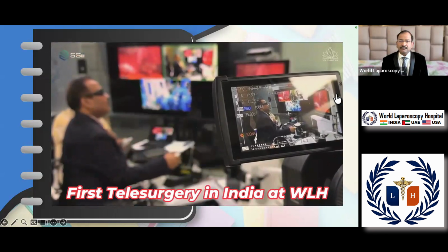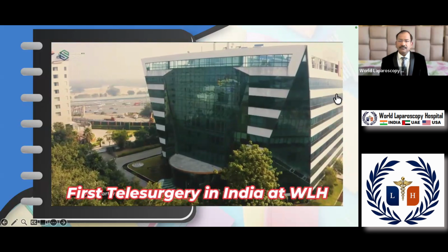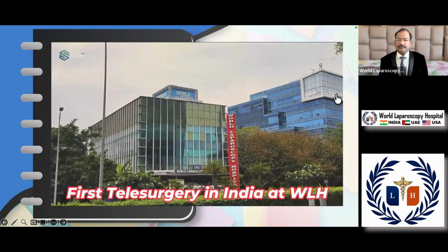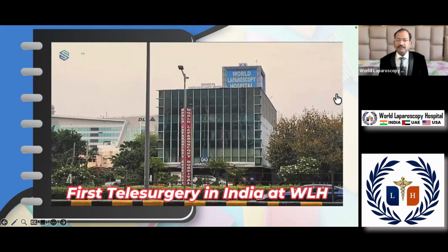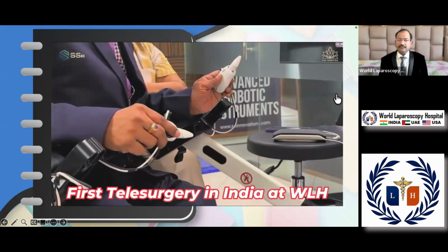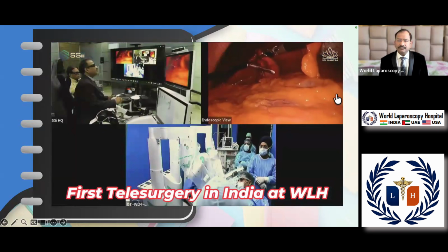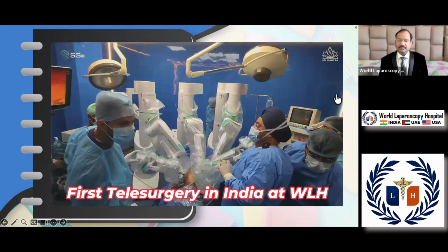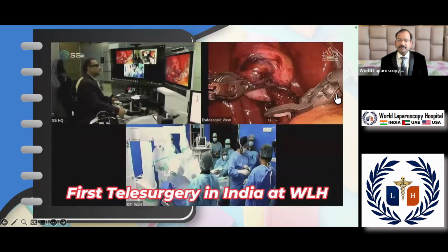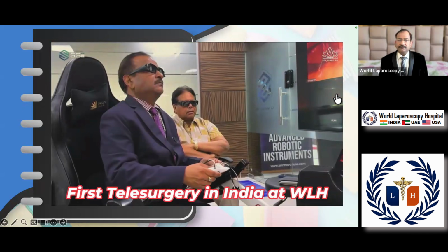Mishra is sitting in our office in Gurgaon, 5 kilometers away. And I must say it was really remarkable, because the whole telesurgery concept existed back in the 80s, when NASA and the Defense Department of the United States funded the research to be able to operate over long distances, in space or in battlefield. Now, with the technology capabilities as well as available high-speed connectivity, it's all real.